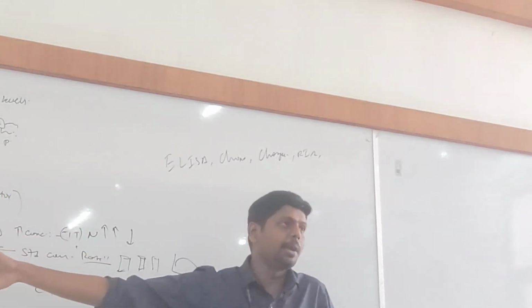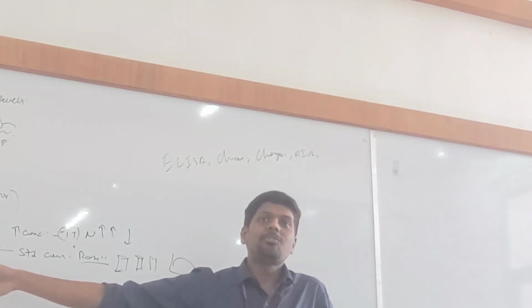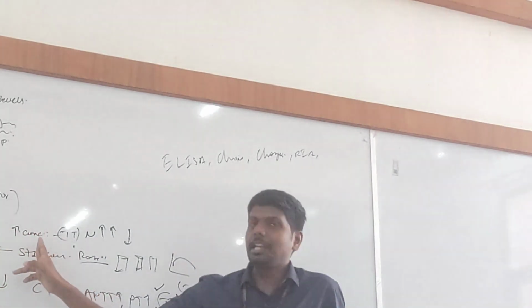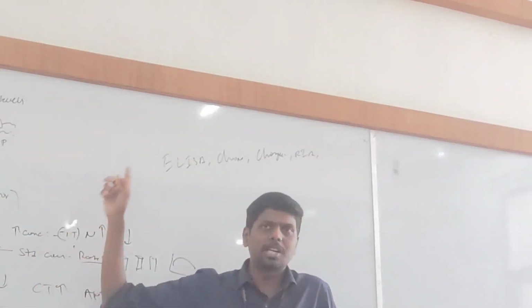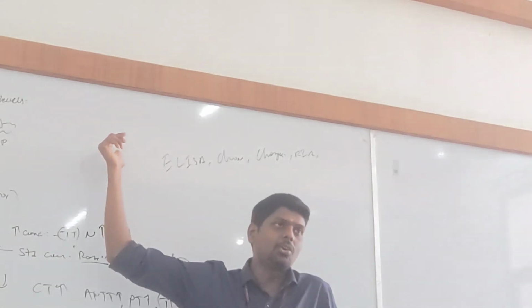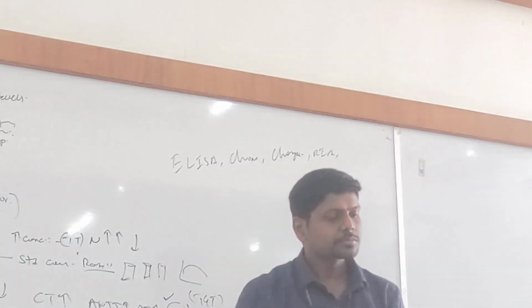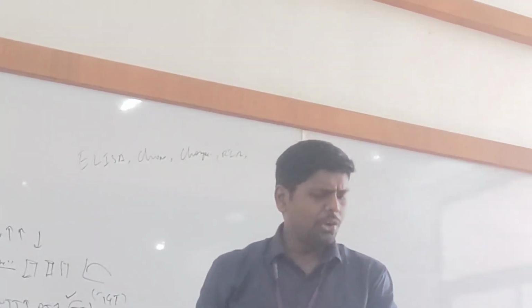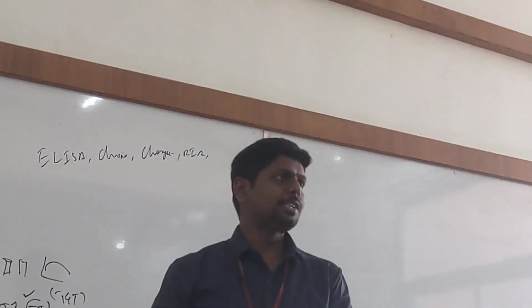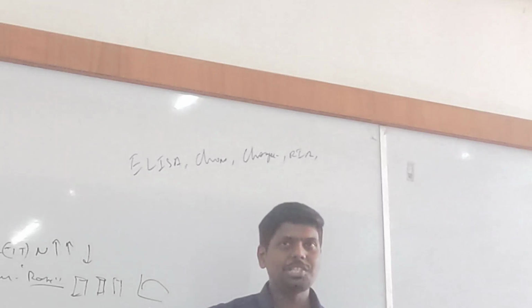If the clot test came with positive results, if we get a very increased thrombin time, definitely we must measure fibrinogen with the ELISA test. We cannot rule out with a single test actually. Anyways, yeah. So now you know what fibrin degrading products are. Now listen, there are other measures.